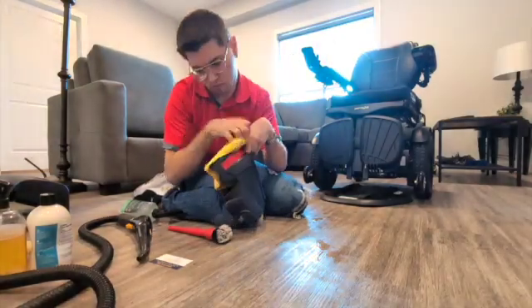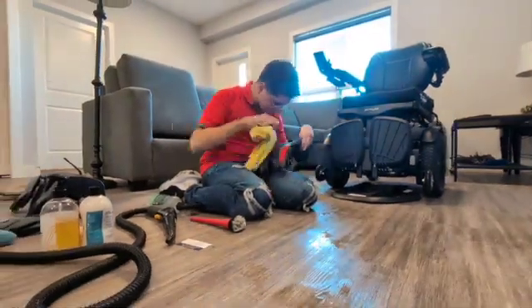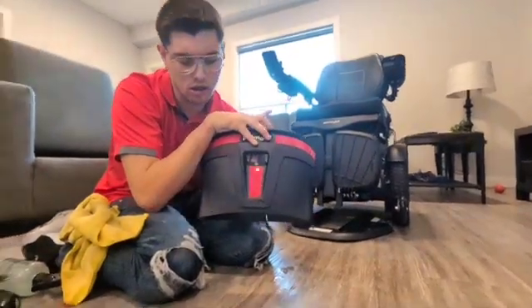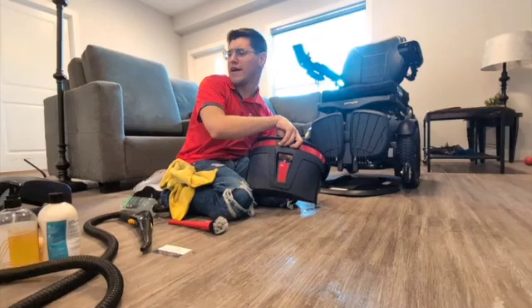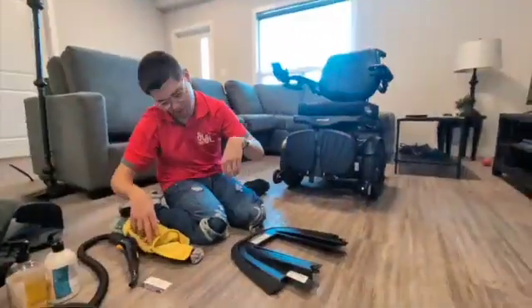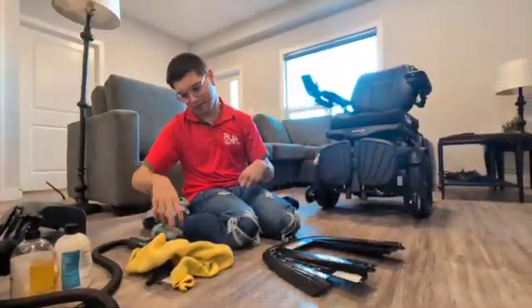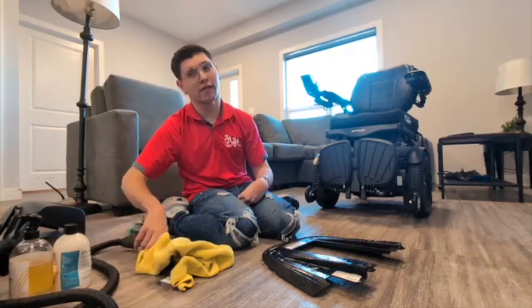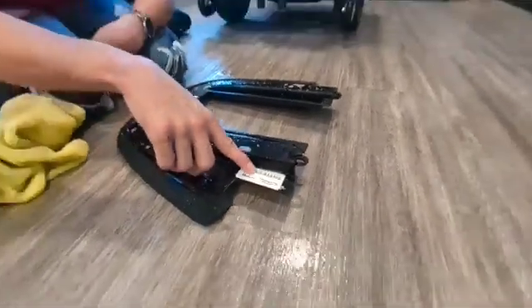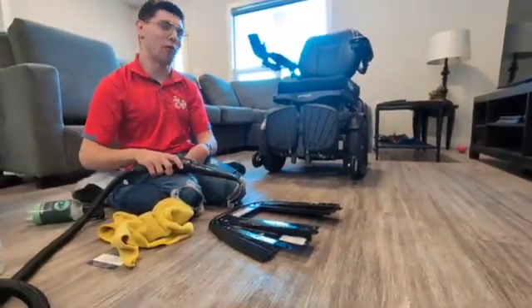The cup holder alone was $90, because these manufacturers know that the government is the main people paying for these wheelchairs. They can charge an astronomical price on these options. So my way around that is to install the lighting on my own. I'm taking both of these off together. I'm not too sure if I'm allowed to remove this one, but if they ask, it came off in the rain. I'm not having a big white sticker on my all black wheelchair.